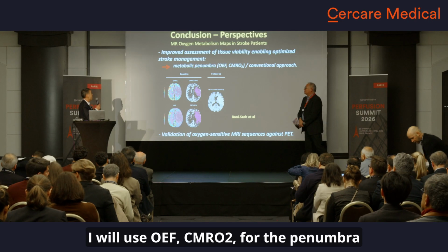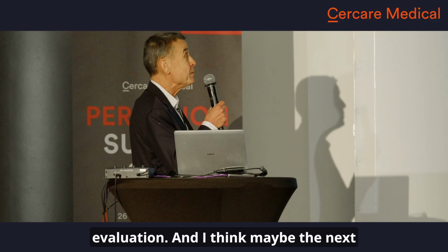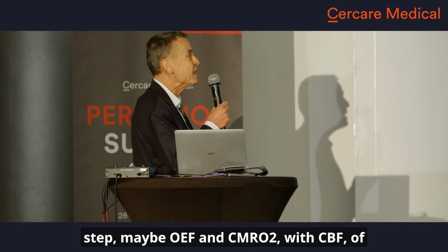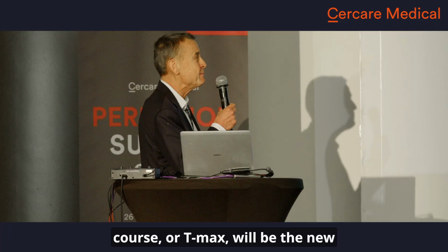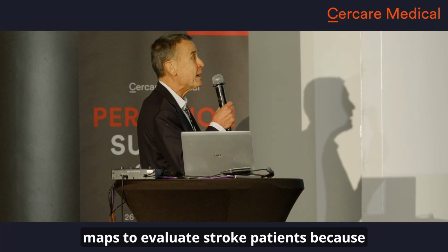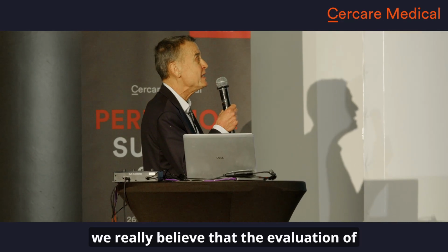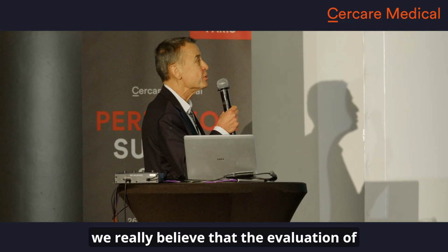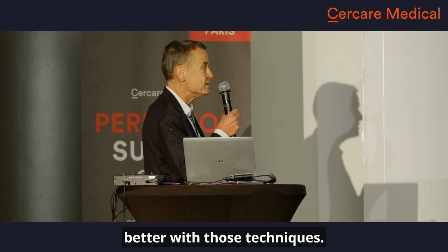I will use OEF and CMRO₂ for the penumbra evaluation. And I think maybe the next step, OEF and CMRO₂, with CBF, of course, or Tmax, will be the new maps to evaluate stroke patients, because we really believe that the evaluation of the core and the penumbra is better with those techniques.